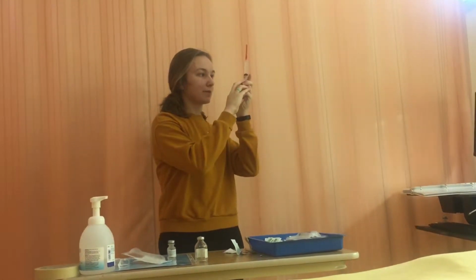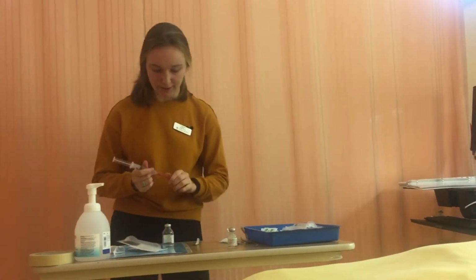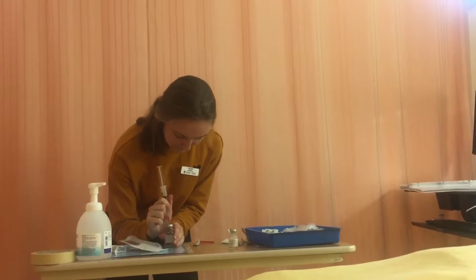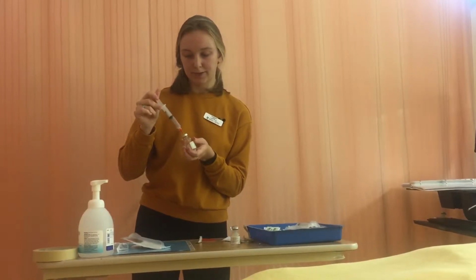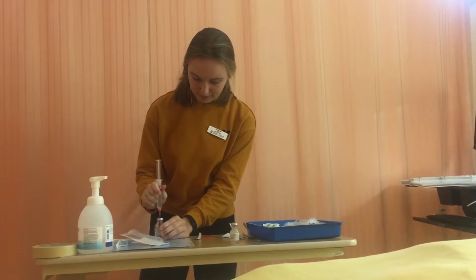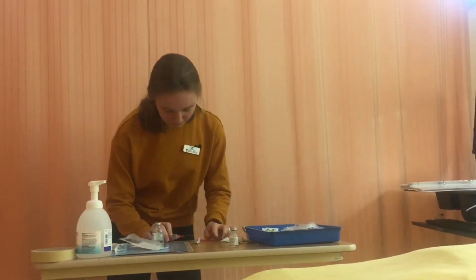So we have 8.2, and now I'm going to instill it into the vial. I already swabbed the top, and now I'm going to inject it. I'm going to instill the sterile water and then let the air release, so the pressure is equal and we don't get any spray back. I'm going to remove the needle, and recap it using the scoop method.